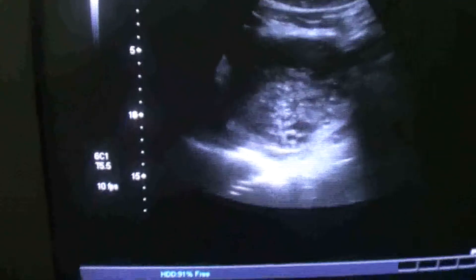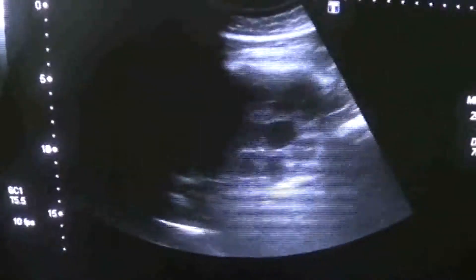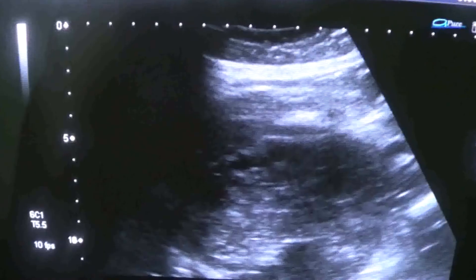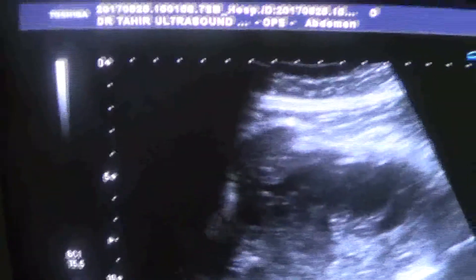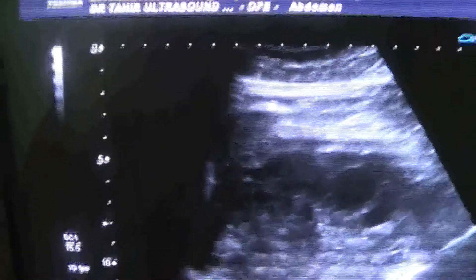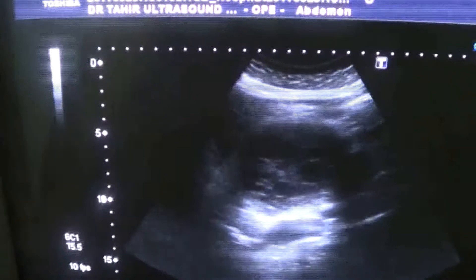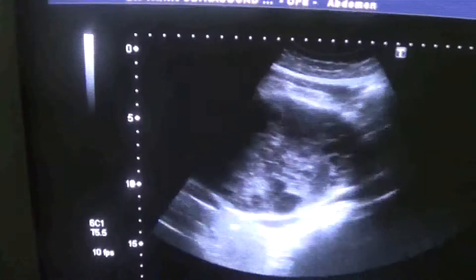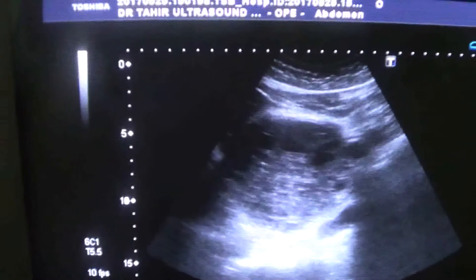This cyst relates to the posterior inferior surface of the left lobe. Now this is the left lobe of the liver, and from here this cyst extends medially up to the epigastric region. You can see it reaches up to the epigastric region. When I give a full sweep of 180 degrees, it does not change its shape — confirming it is a cyst. We can also see posterior wall enhancement.